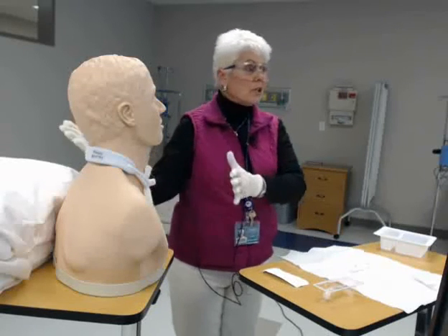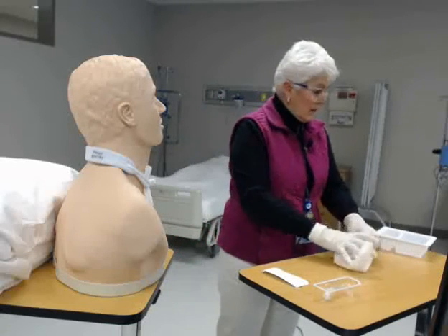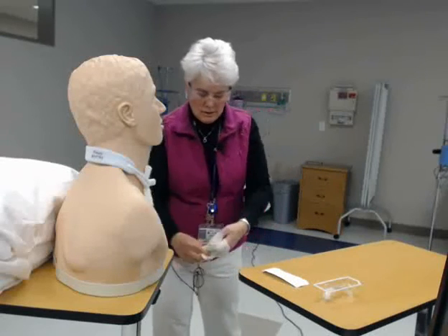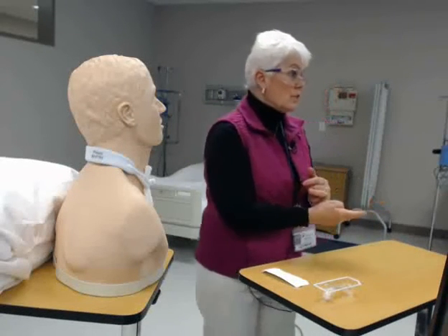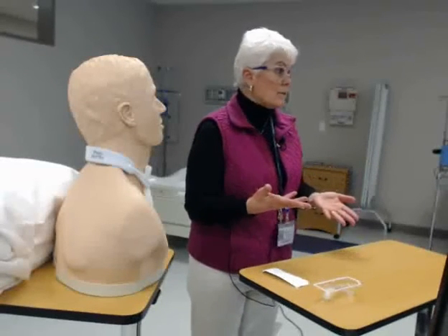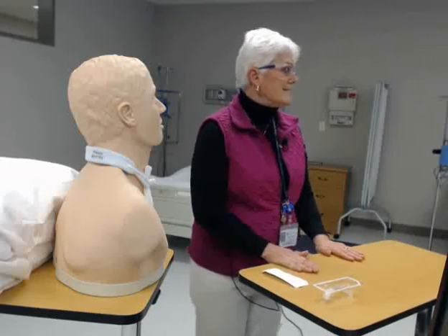Once you're done, put the patient in a comfortable position and replace any oxygen that was removed. Throw all used supplies in the trash and remove your gloves. Wash your hands and document: that you performed the tracheostomy care procedure, what kind of secretions were on the old drain sponge, how the patient tolerated the procedure, and how they responded. And that is it.